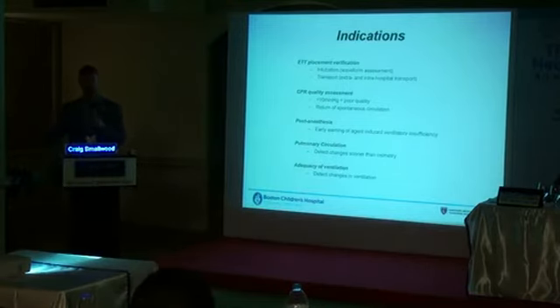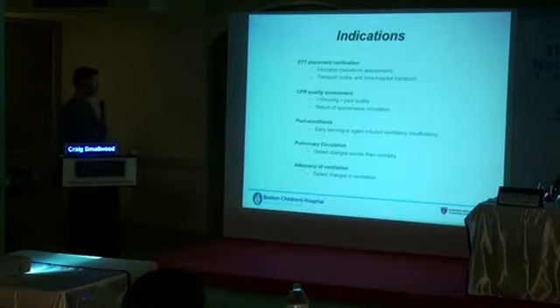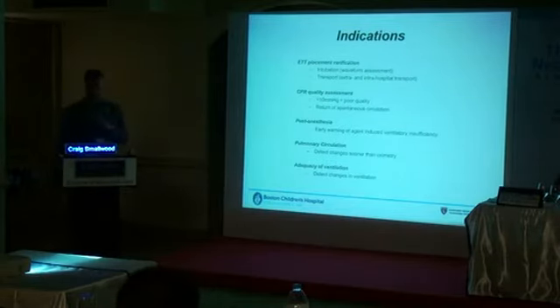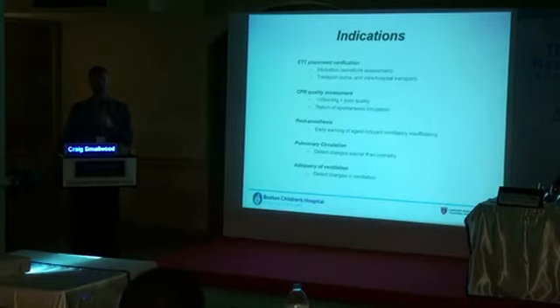So I spent a fair amount of time talking about VCO2, the flow of CO2, with just end-tidal. You can get some indications as to whether or not you've improved or worsened your pulmonary circulation, your pulmonary perfusion within the lungs. And adequacy of ventilation, I think that's probably the principal reason we use it, is just to get an assessment of ventilation during the time period between blood gases. And honestly, we don't even get that many blood gases.